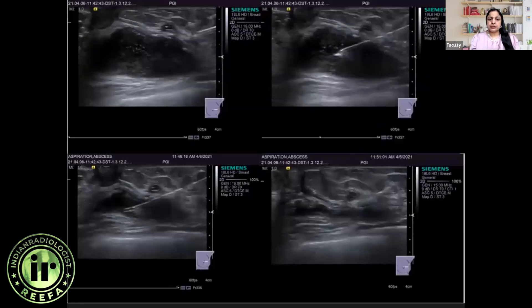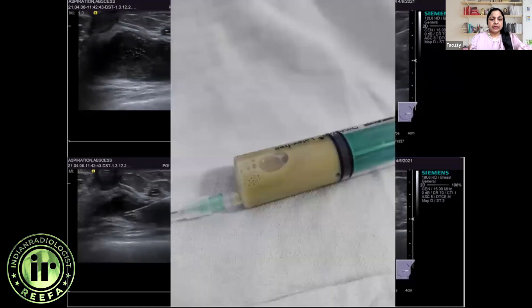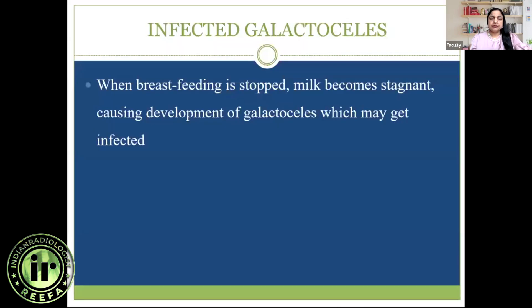A therapeutic aspiration was planned using an 18-gauge needle. For breast aspirations we use 18-gauge needles, as opposed to core biopsies which are done with 14-gauge needles. With an 18-gauge needle it is easier to aspirate the fluid. The entire abscess was aspirated and coaptation of the abscess walls was seen in the final image. Frank pus was aspirated and the patient was kept on follow-up with oral antibiotics, with no recurrence of filling.